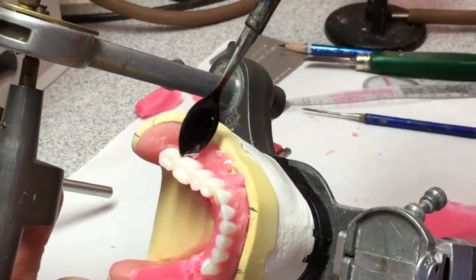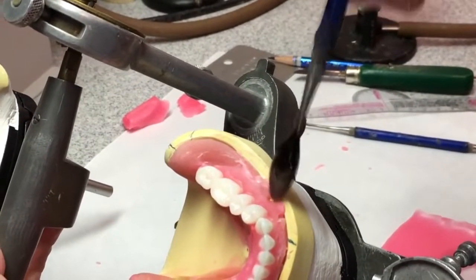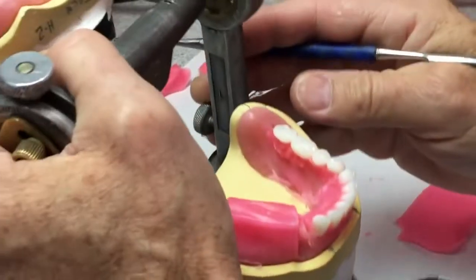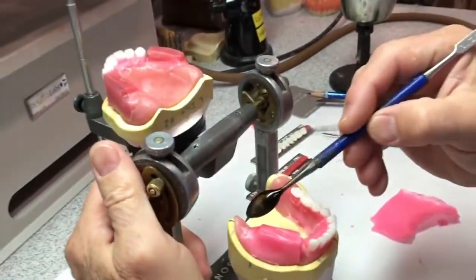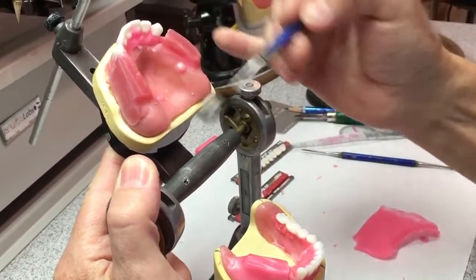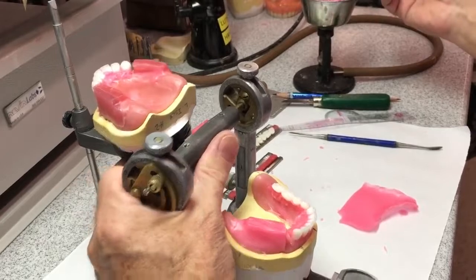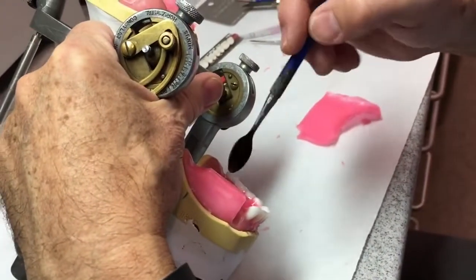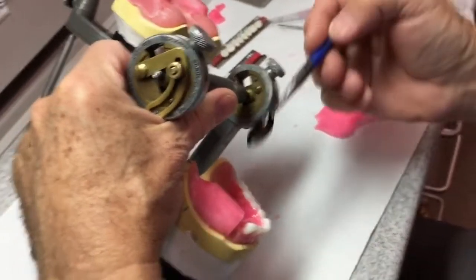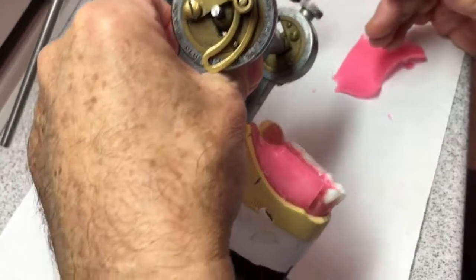Now I need to seal these down so they don't move. Whether you set maxillary posteriors first or mandibular, either way you're going to have a little adjustment to do at the end. Another method is to set the maxillaries first — you scribe a line on the mandibular bite block showing where that ridge is underneath, then set the maxillary lingual cusp on that line, so it results in the central groove of the lower being directly over the ridge. If you set the mandibulars first as I'm doing now, you'll make an adjustment occlusal-gingivally.